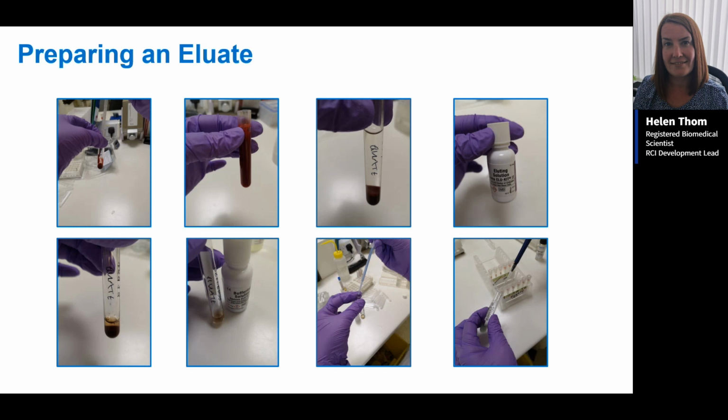So you take a ml of your packed patient red cells from your sample, but even though you might have taken the plasma off this already, there could just be some left over. So what you do is fill it up with wash solution or saline, give it a few washes.